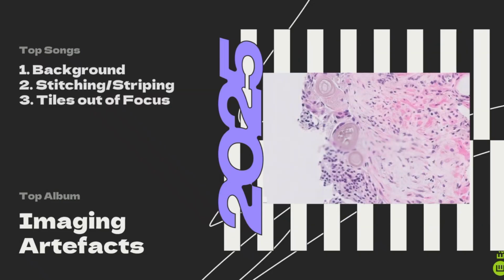You can see there's a rectangular patch in the center of this image. It's just a tile that's out of focus. And again, it's just when it captured that tile, it's just been knocked out of focus, but it's got well-defined edges around it. And again, just rescan the slide. When you're doing your QCing, just rescan the slide.